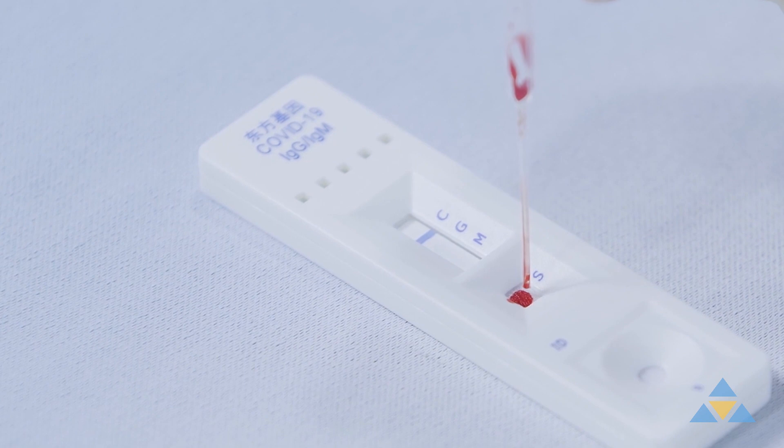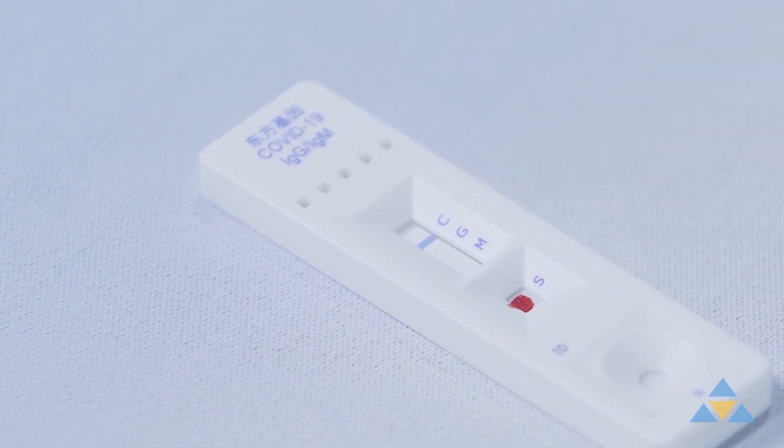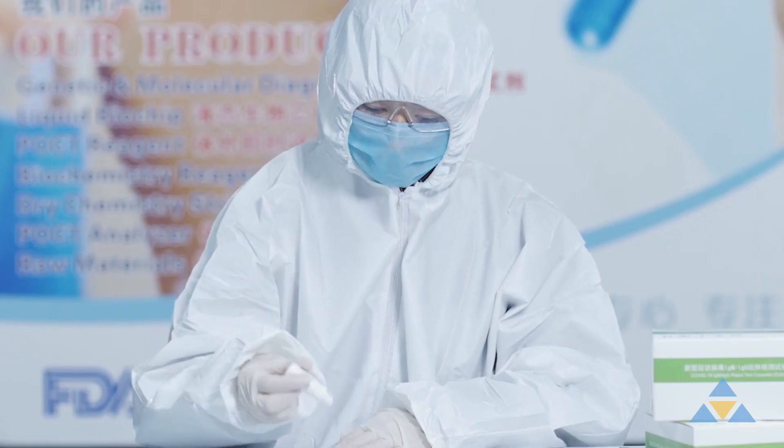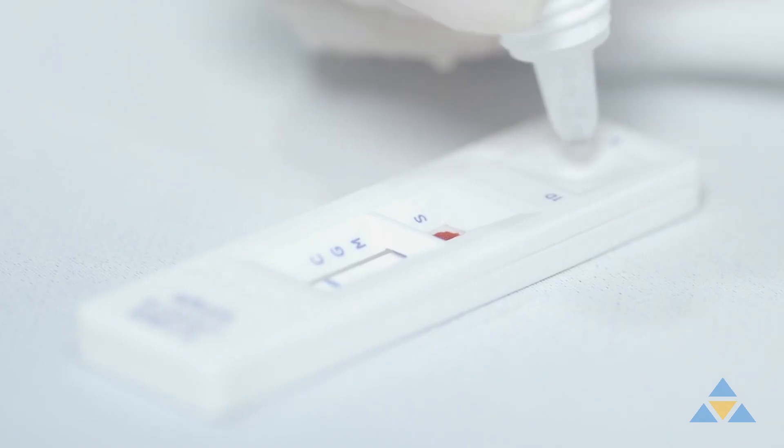Add one drop to the specimen well labeled S on your testing cassette. Then immediately add two drops from the buffer to the buffer well labeled B on your testing cassette.